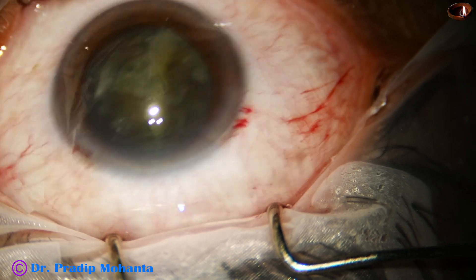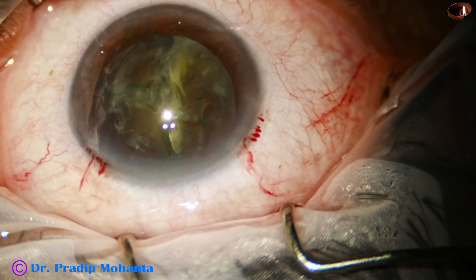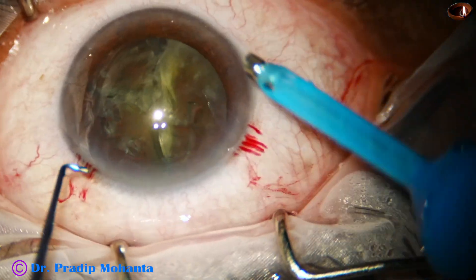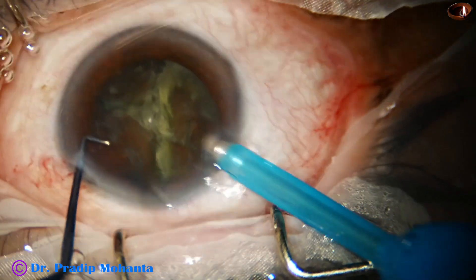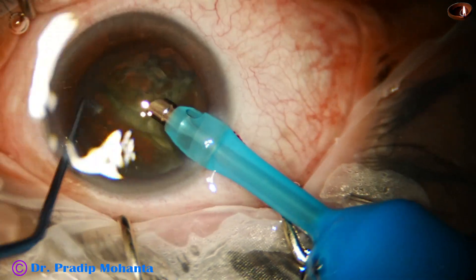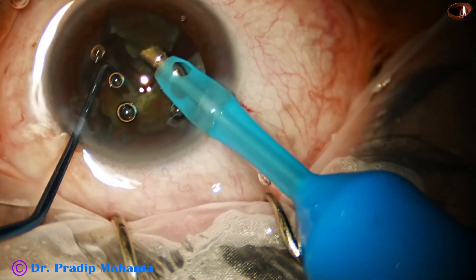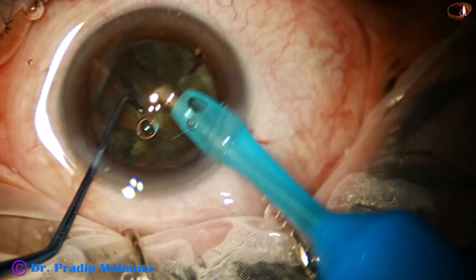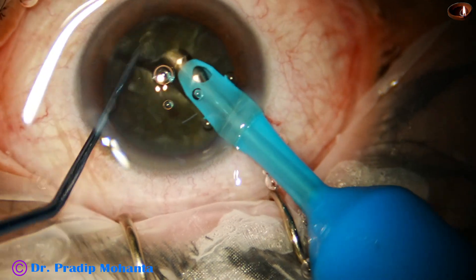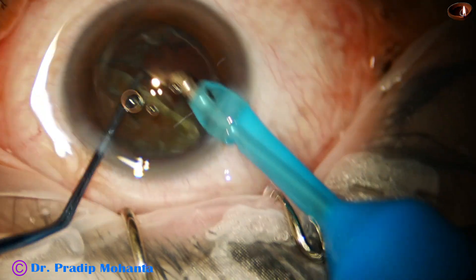One hemi-nucleus has been divided into two pieces. Now the handpiece goes in with its bevel down. The nucleus sustainer is used to rotate the nucleus several times. The two free nuclear pieces of one hemi-nucleus are being emulsified. Ultrasonic energy used is 70%, flow rate is 48 ml per minute, and vacuum is 480 mmHg.